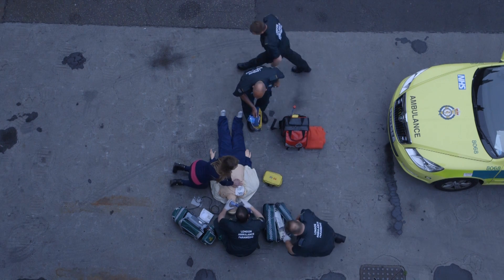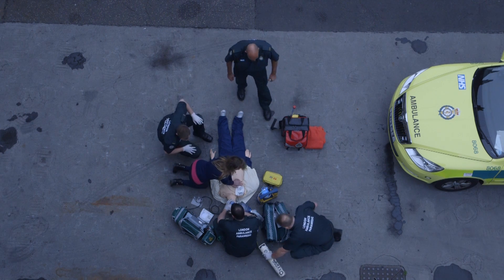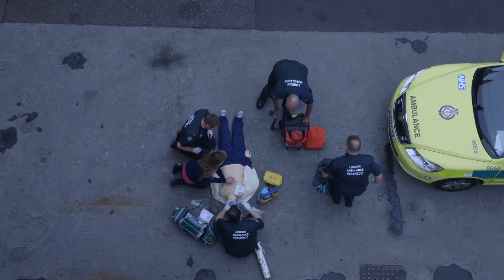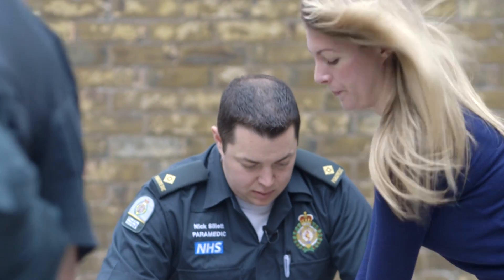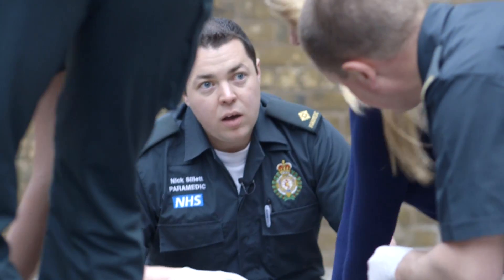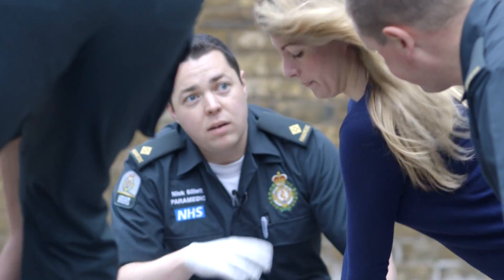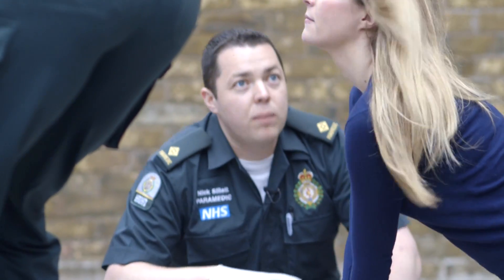Hi, I'm Nick. This is Catherine. Adult male found in cardiac arrest by Catherine. Good bystander CPR. She's received one shock so far. We're coming up to another analysis now. Nick, this is Chris. Hello, Chris. And Paul, and I'm Mick. Hello, Mick. Hello, Paul. Nick, do you want me to take over compressions on the next one? Yeah, we can do it. If Mick's happy, we'll do an analysis when Mick's ready and then we'll get you to take over. Nick, if you just continue whilst I get the checklist out.